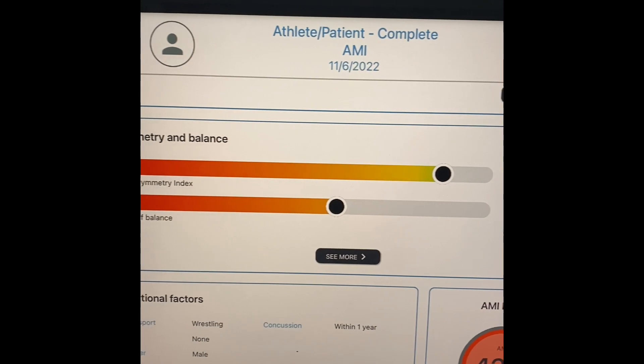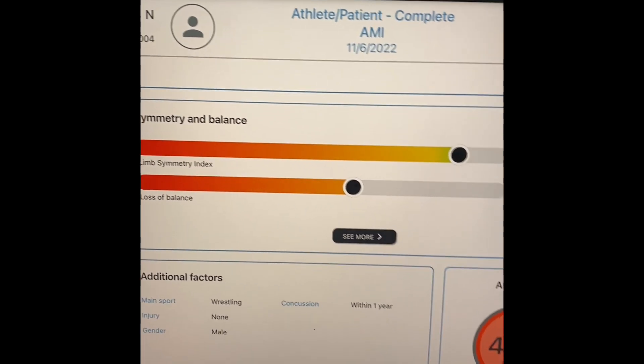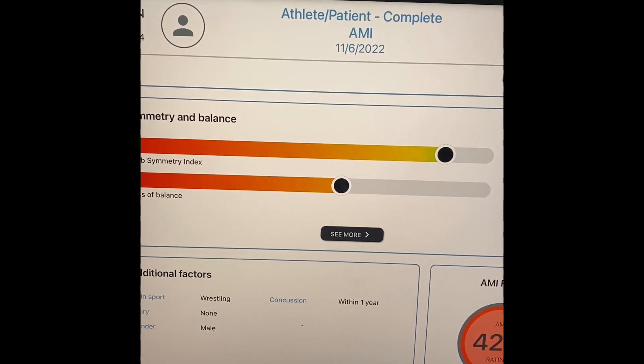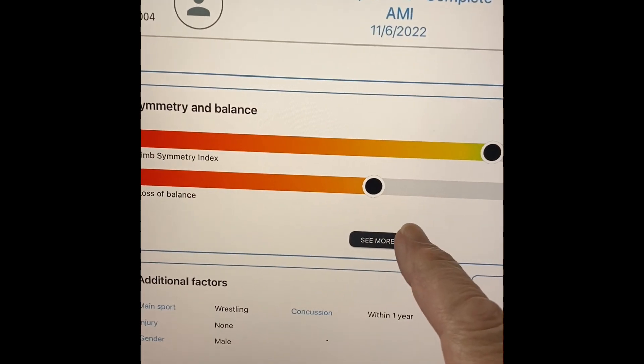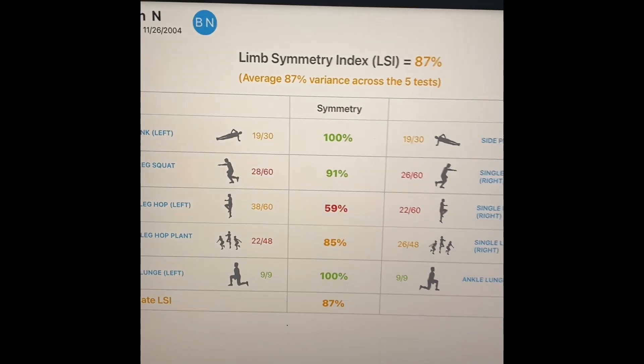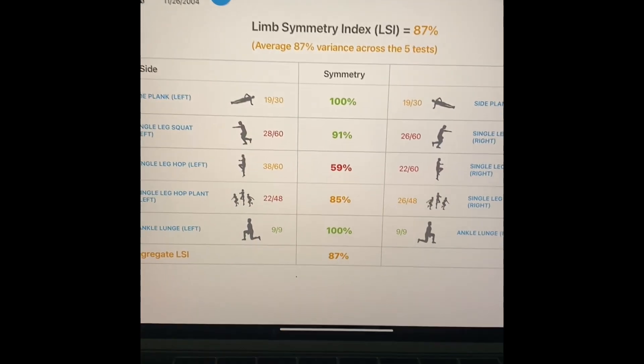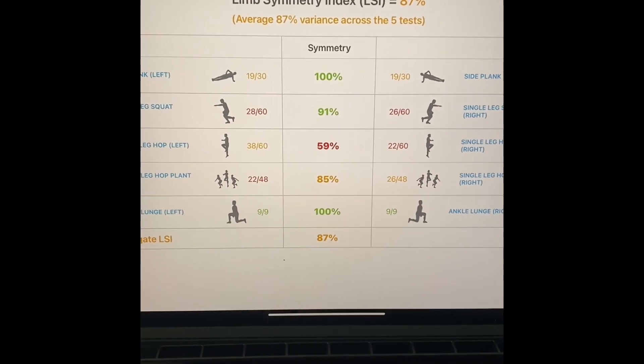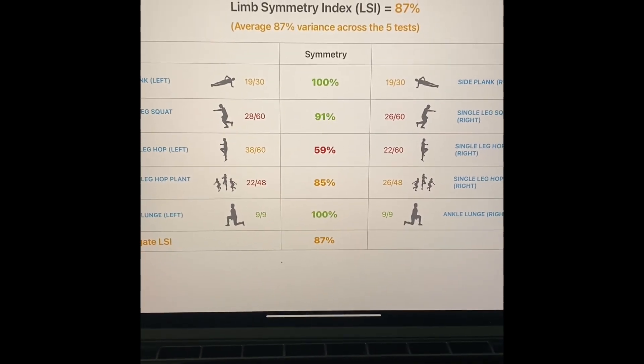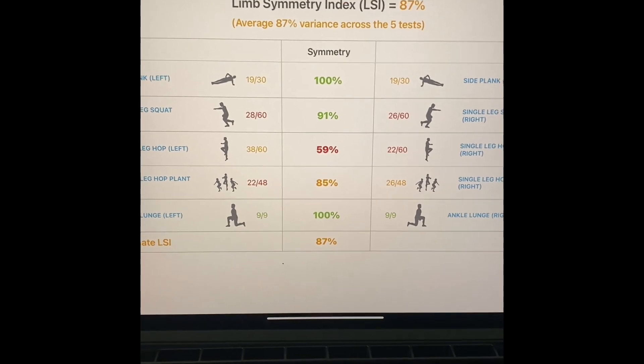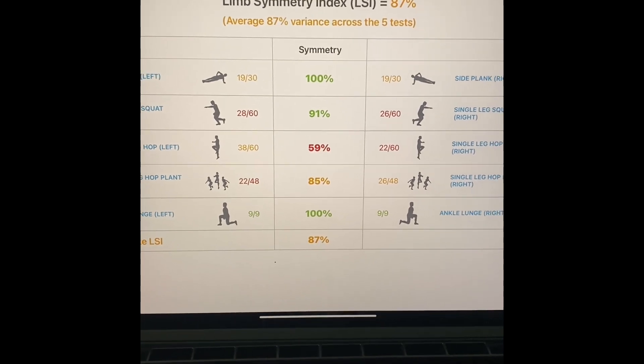Which is the ability to dig into some of the details. So the first thing that makes the AMI different than any other assessment on the market, number one, is that we provide you this limb symmetry index page.